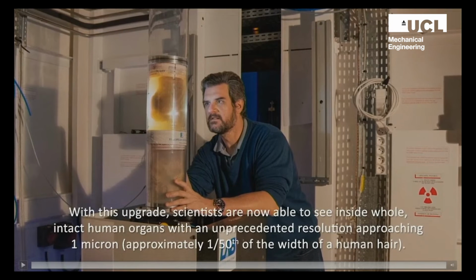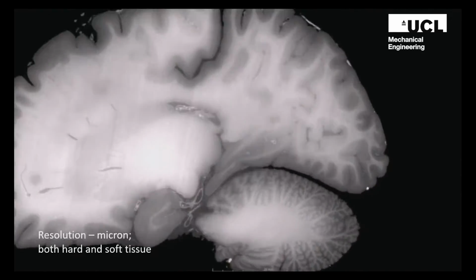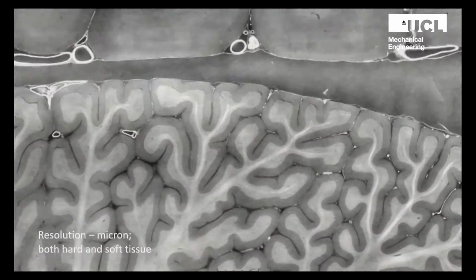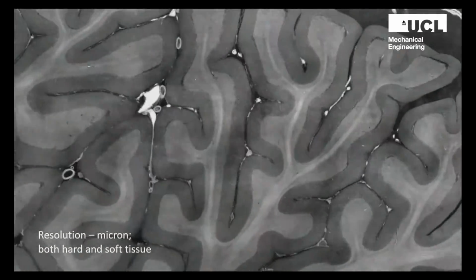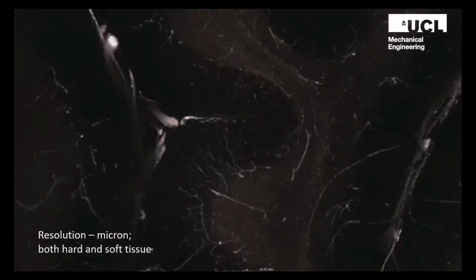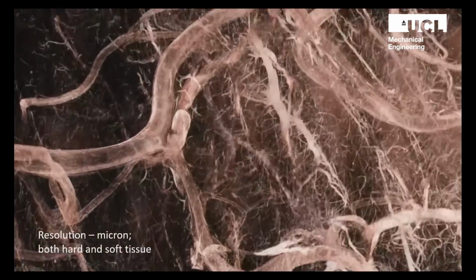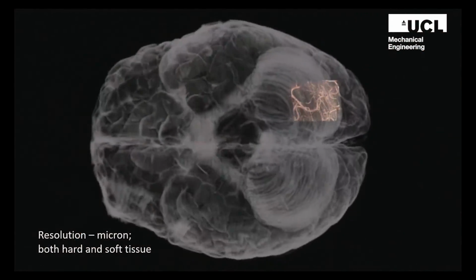Using this together with Paul Tafforeau, who's on the screen behind me, virtually appearing, we developed this new technique called Hierarchical Phase-Contrast Tomography. I'm not going to explain it, but I'll show you the results. This is a human brain with X-rays, and it's showing not just hard matter, but soft matter. We're resolving down to 1 micron locally. That's 1,000 times higher resolution than the current medical CTs. Since that's in 3 dimensions, that's 1,000 cubed or 1 billion times more information, resolving the microvasculature as shown here and many other features in the brain.